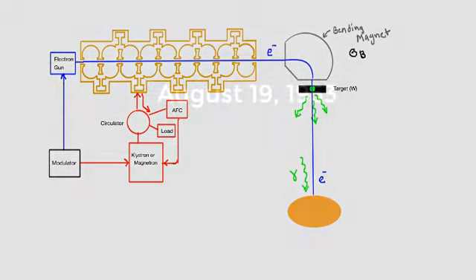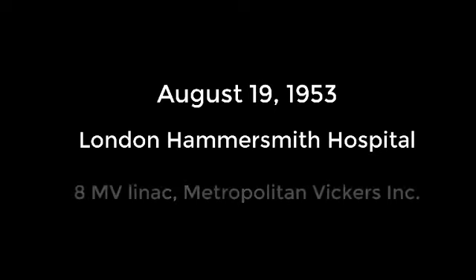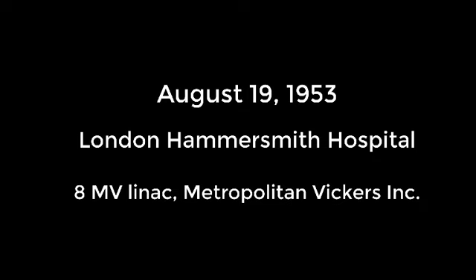So we come to August 19th, 1953. That was the first treatment of a patient with a linear accelerator. That happened at London Hammersmith Hospital, and this was an 8 MV linac developed by a company that is no longer manufacturing these units. Around the same time, there was also development going on in California. That work was pioneered by Dr. Henry Kaplan, an oncologist who worked with physicists there to develop linear accelerator technologies like we've learned about.